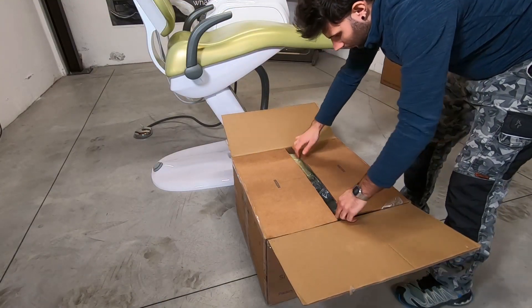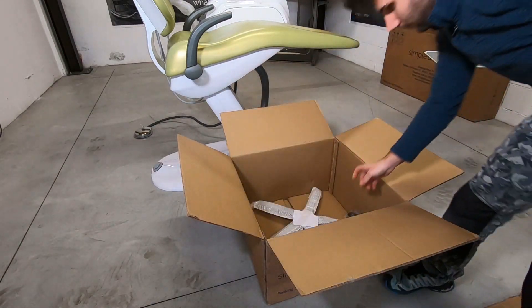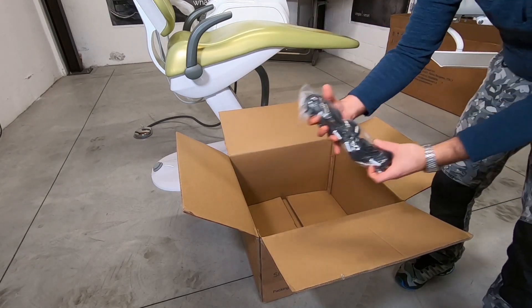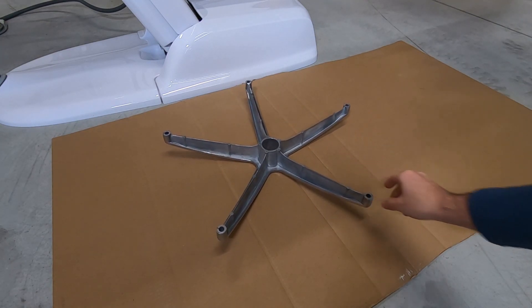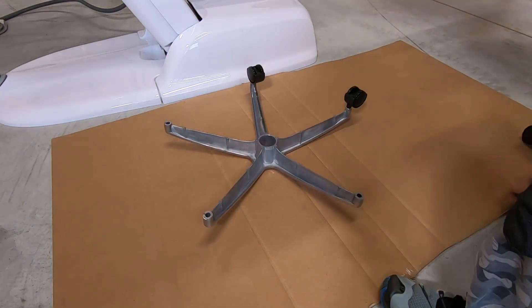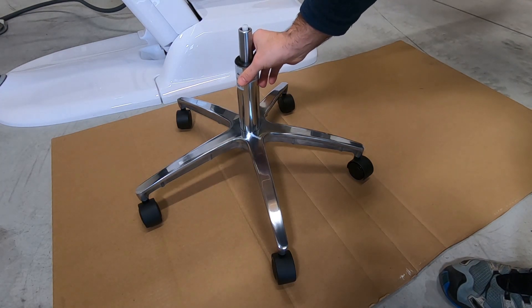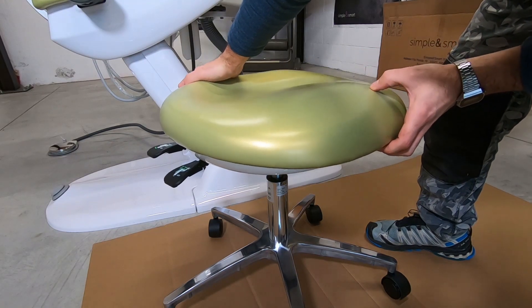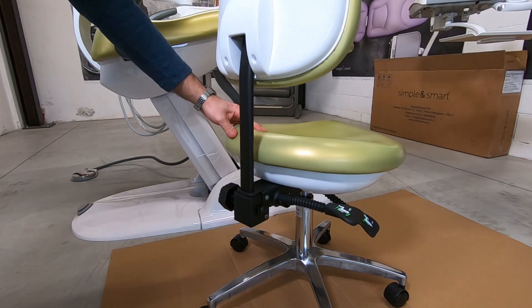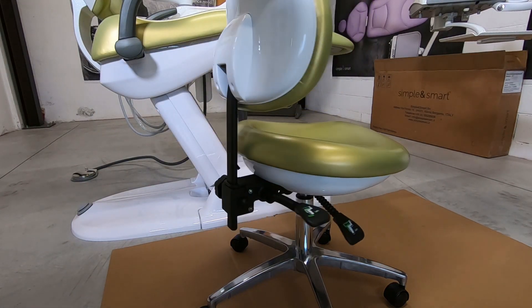In the stool box there are the backrest and other components. Place the piston and then the seat. Put the backrest in its support and fix it by closing the knob. Thank you for choosing Simple and Smart.